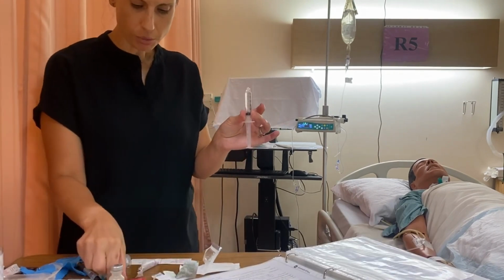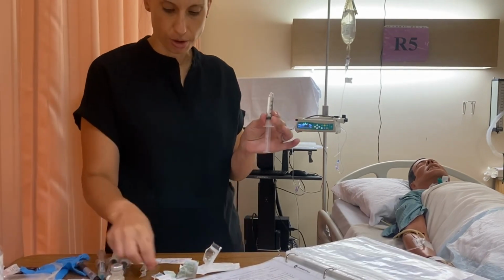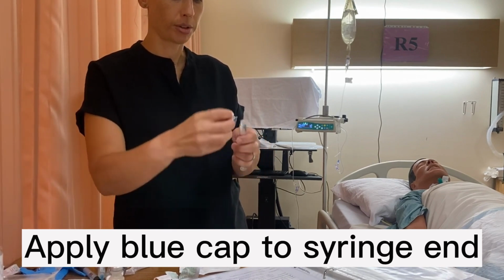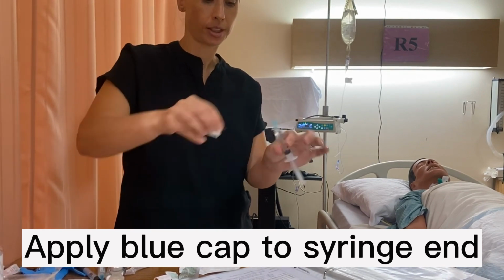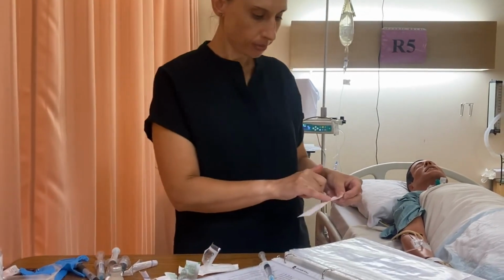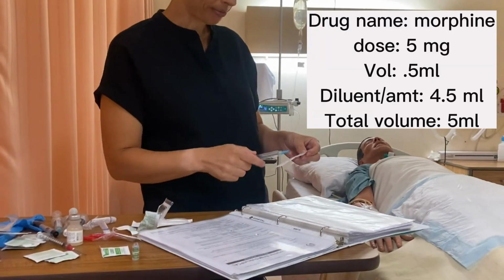And now, because we don't want to take any blunt fill needles to our patient's room, what we're going to do is replace that cap with a blue cap sterilely. And now we just need to affix a label. So reviewing, morphine, 5 milligrams, 0.5 mLs.